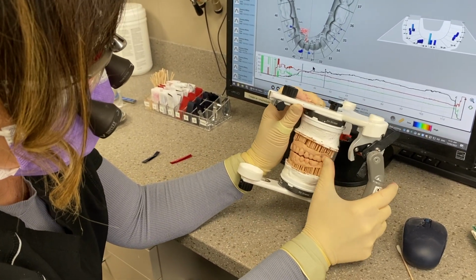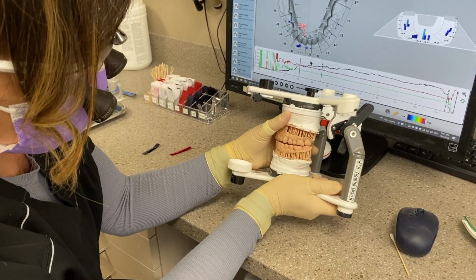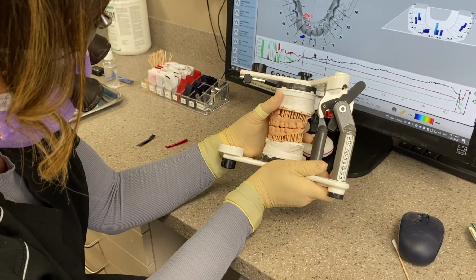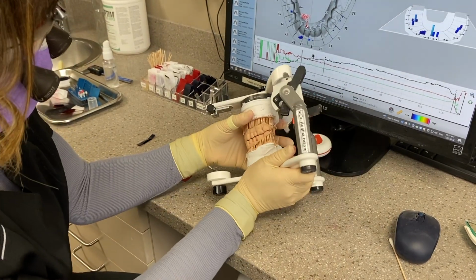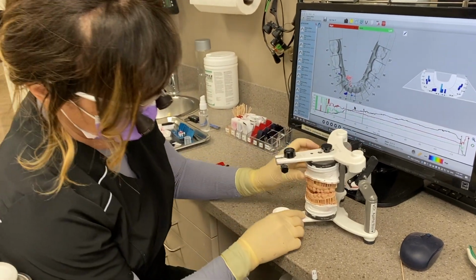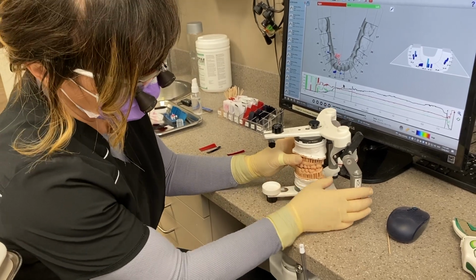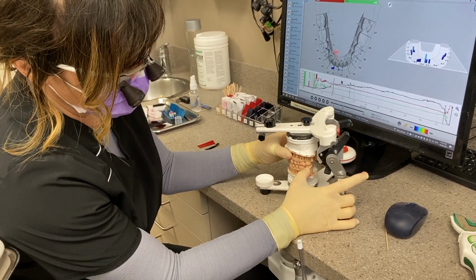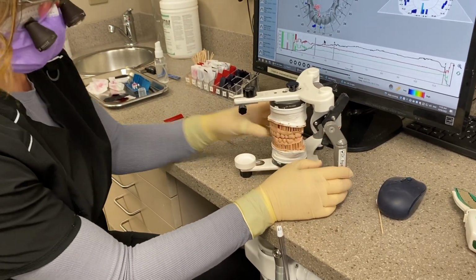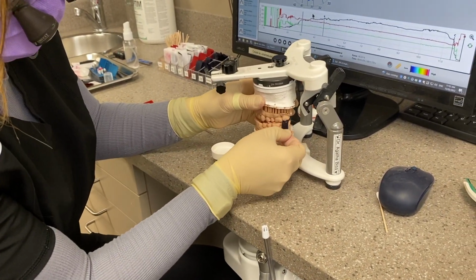But this tooth and this tooth still have that significant bone loss, so I am going to adjust them partially just to get them out of the imminent bone loss issue. And then I can talk to the patient to see if she is interested in restoring further. Okay. You have to really remember to go back to occlusion from our early days in school, because if you just adjusted that buccal cusp on the lower, you'd be adjusting the wrong tooth, right? Because you want to keep that one in occlusion when she bites down, but you want it to clear on lateral slides. And the upper cusps are not supposed to be in occlusion, so we're going to make sure that the upper is clear.